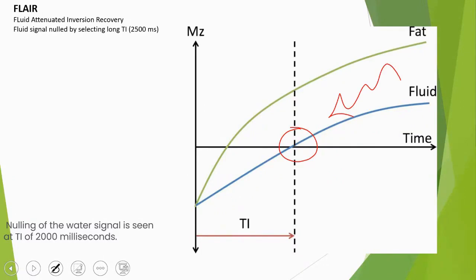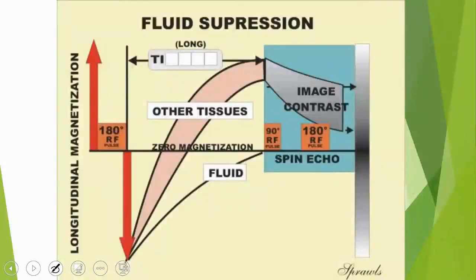Oh, so you want to say that at this time, the fluid is what will show up for you, right, doctors? At this time, what will appear? It will show a beautiful black fluid. It will be dark at this point. This is what you did.